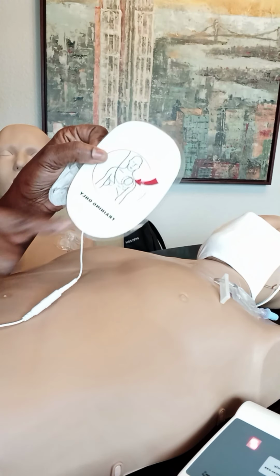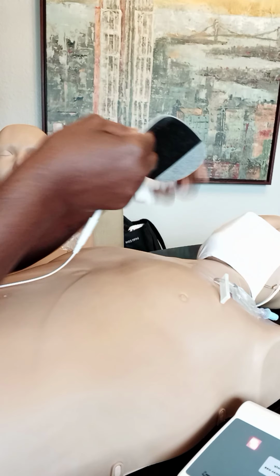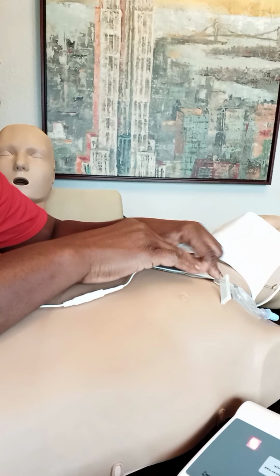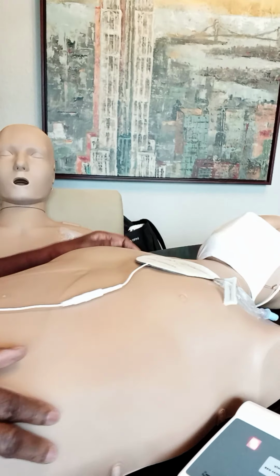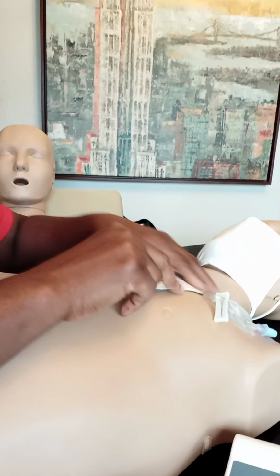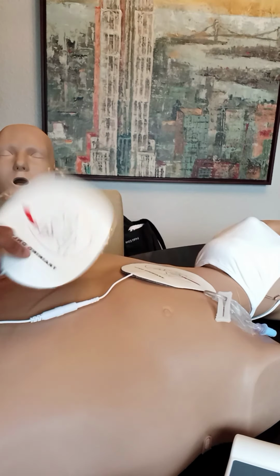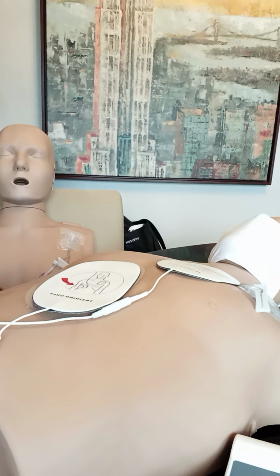This goes to the right side. Apply pads to patient's bare chest. Plug in pads connector next to flashing light. Right next to the catheter. Otherwise, it would be where? Probably over here a little bit closer. Apply pads, plug in connector, making sure that it sticks correctly. This is going to the left side, the left lower side. But I have my medicine patch there, right? So I'm going to remove it.